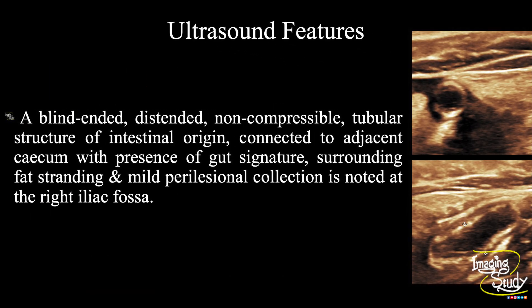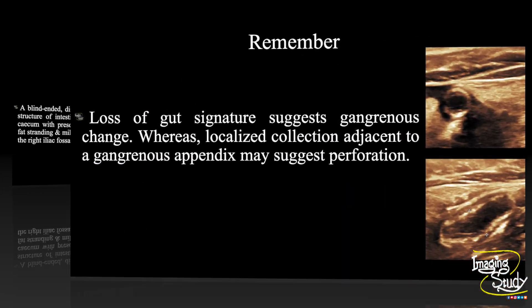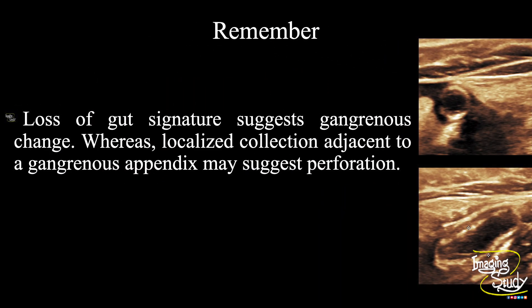In summary: a blind-ended, distended, non-compressible tubular structure of intestinal origin connected to the adjacent cecum, with presence of gut signature, surrounding fatty stranding, and mild peri-appendiceal collection noted at the right iliac fossa — indicating a case of acute appendicitis. Take-home message: loss of gut signature suggests gangrenous change, whereas localized collection adjacent to a gangrenous appendix may suggest perforation.